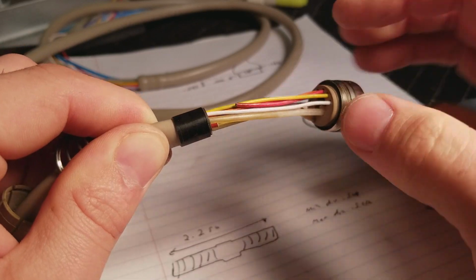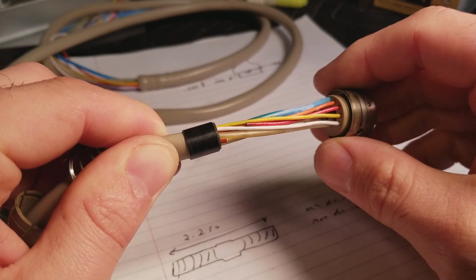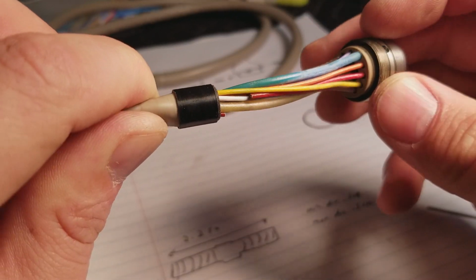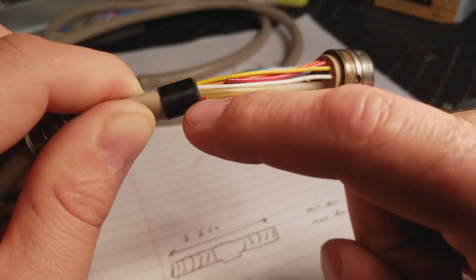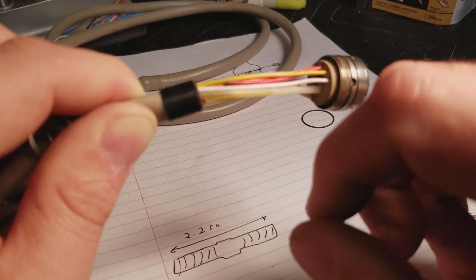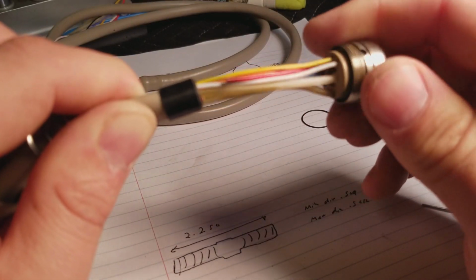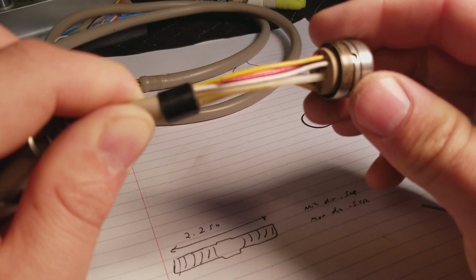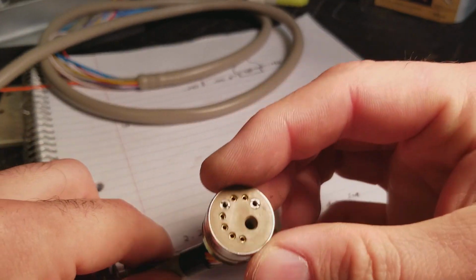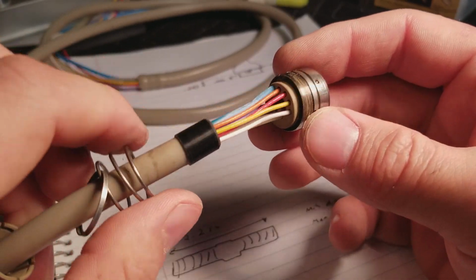And oh, look at this one. So it actually appears the problem is this red cable has broken off. So you can see that it's the first time I'm taking this one apart. So what I need to do now to fix the problem here is simply splice these two back together. So I'm just going to strip them back, solder them, put a heat shrink tubing over them, and this tubing should be good to go as new. And just the reverse assembly puts this all back together. So that's about it for that.